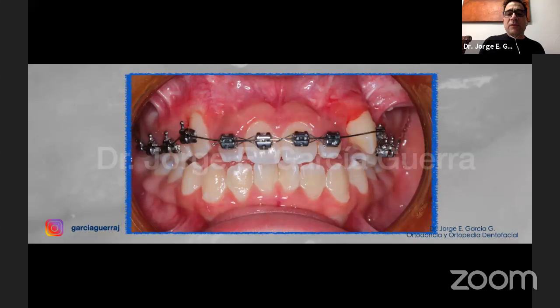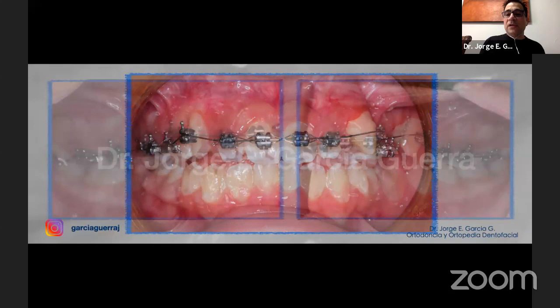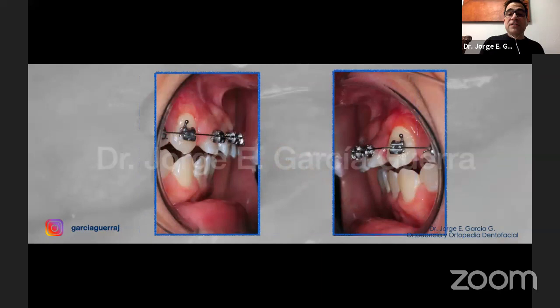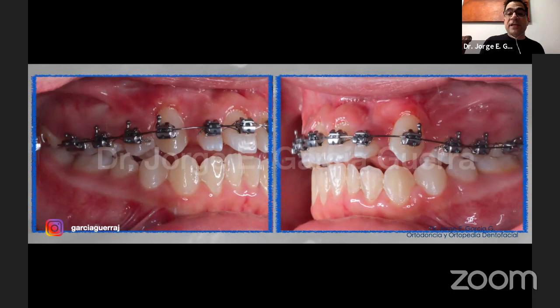You can see the small crowns of the lateral incisors. And well, from this point on, it's just a simple case. We need to use very light forces. These are some advancement pictures. And you can see the inclination of the lateral incisor. So it's very important that we use very light forces so we could just finish this case. Obviously, this patient was 10 years old when she started.